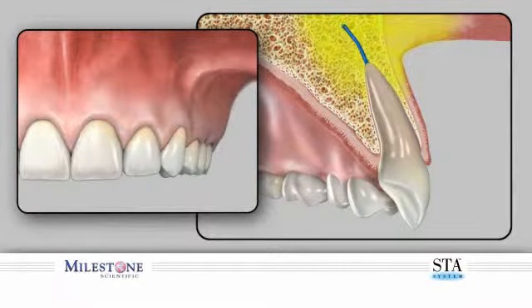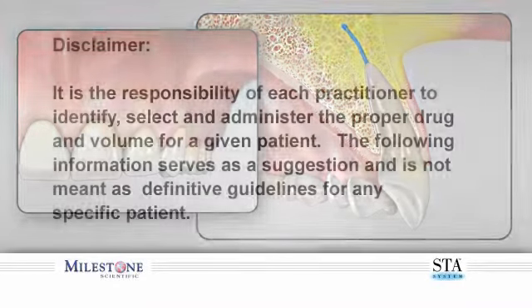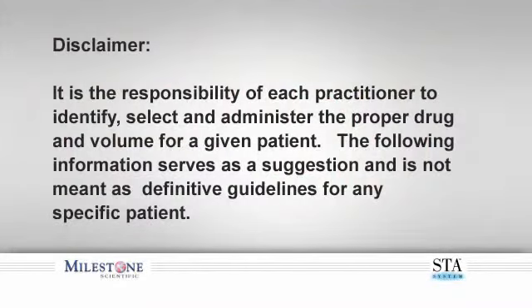The STA system precisely controls the flow rate and pressure below your patient's pain threshold level, thus resulting in a more comfortable experience. The STA system is a valuable addition to your practice and one that all your patients will greatly appreciate. It is the sole responsibility of each practitioner to identify, select, and administer the proper drug and volume for a given patient.